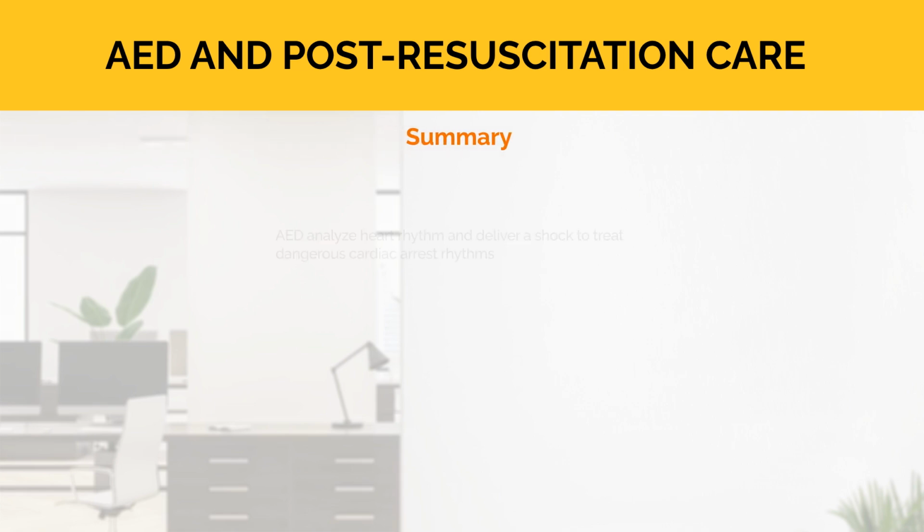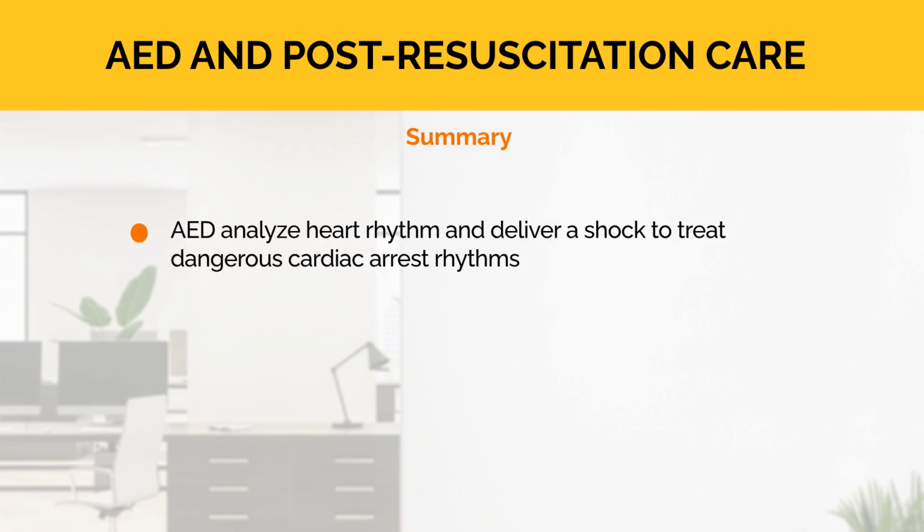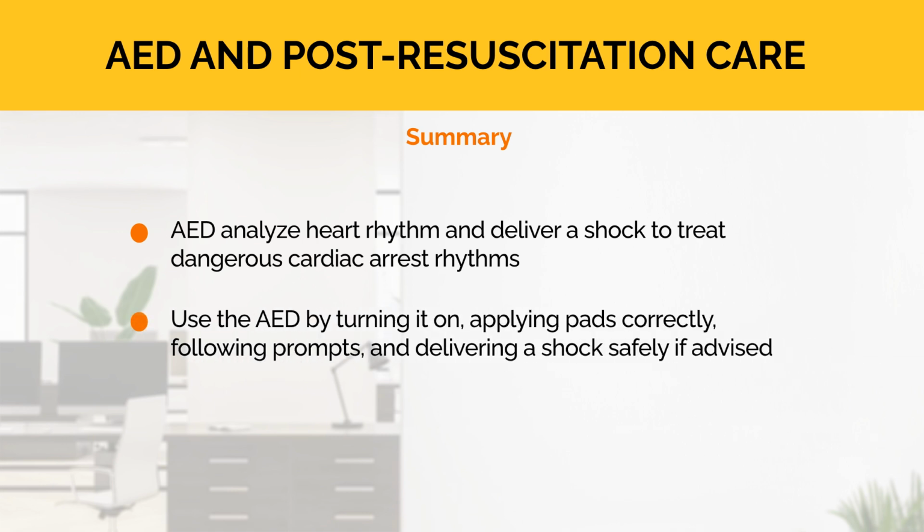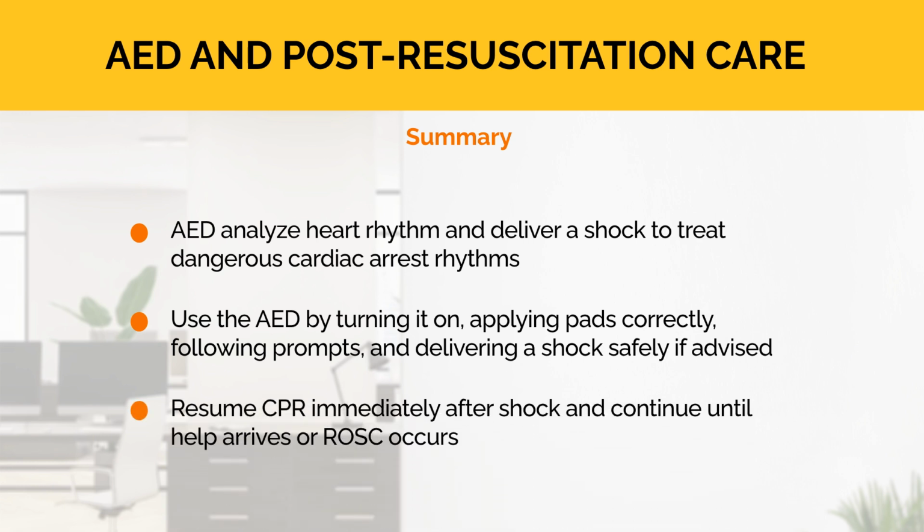In summary, AEDs analyze heart rhythm and deliver a shock to treat dangerous cardiac arrest rhythms. Use the AED by turning it on, applying pads correctly, following prompts, and delivering a shock safely if advised. Resume CPR immediately after shock and continue until help arrives or ROSC occurs.